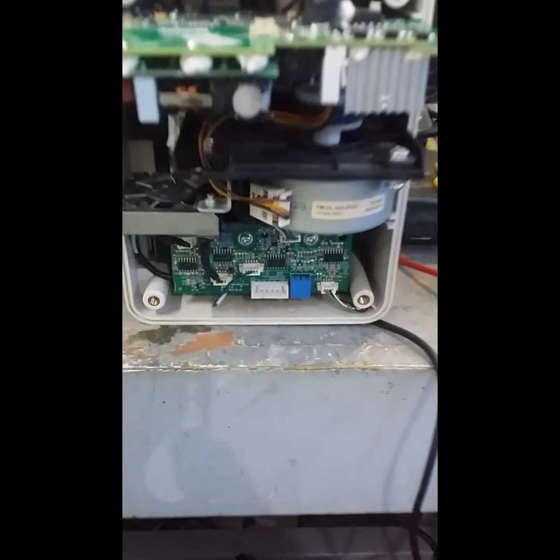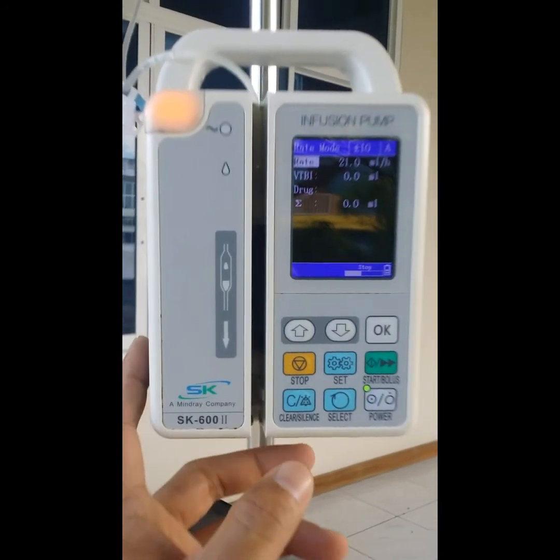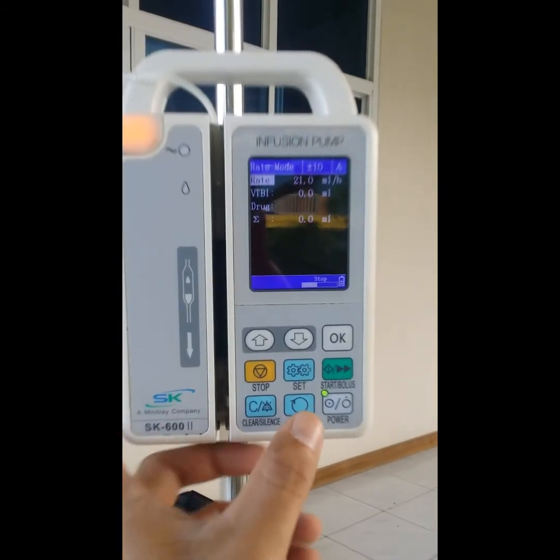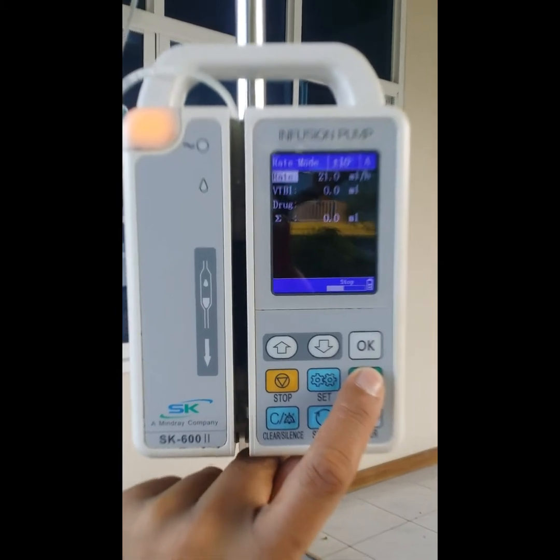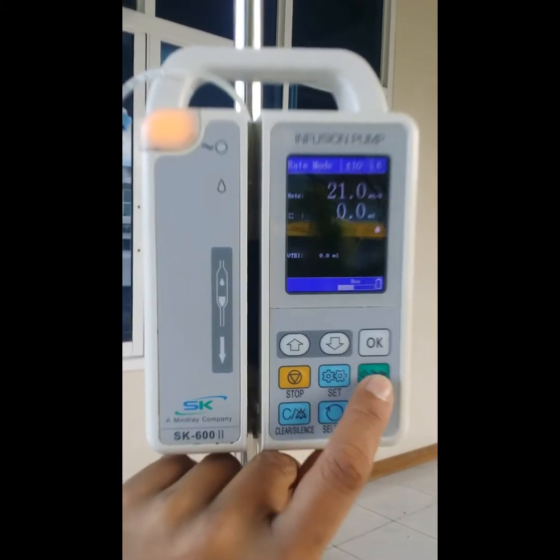We're going to test it. Make sure it is secure — we are going to start it up and let's see if it functions.